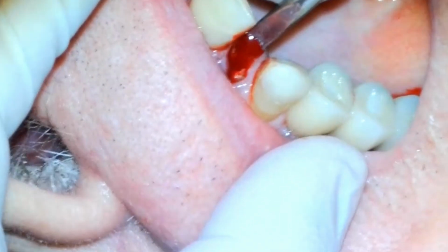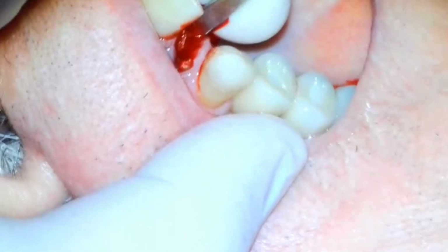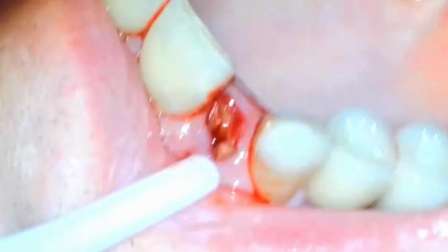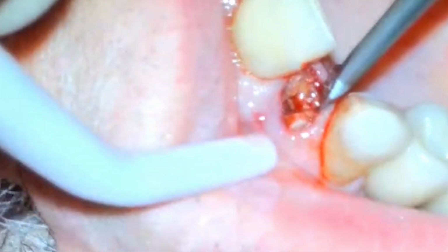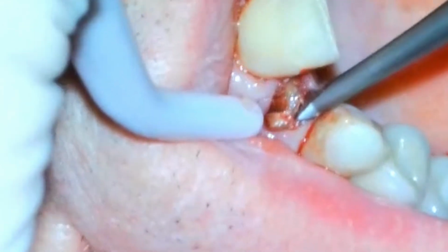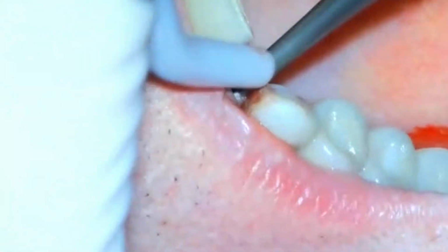So now I have a little bit more room to play in, and we know that there's no bone on the cheek side of the tooth because of that infection. So when I go to remove the tooth, I'm going to use my elevators, I'm going to use my luxator, and now I switched over to my favorite, the spade proximator. I'm going to use it on the roof of the mouth side and in between, and just try to wiggle it, get it moving. There you can see what's left of the root is actually in pieces. There's a few sections there. So hopefully we can get the whole thing out.